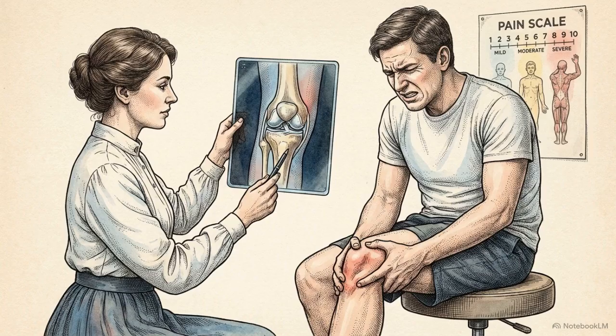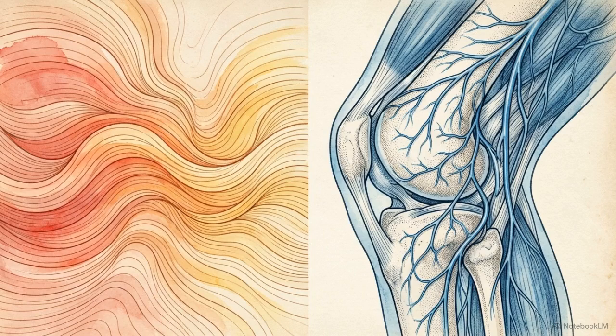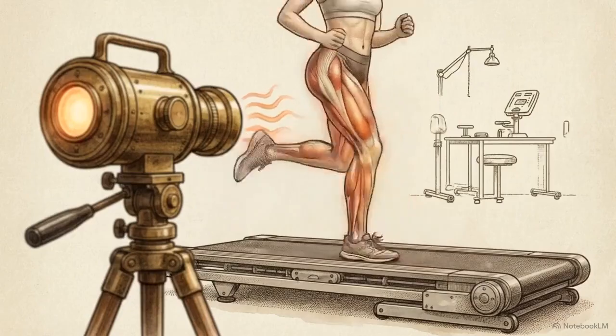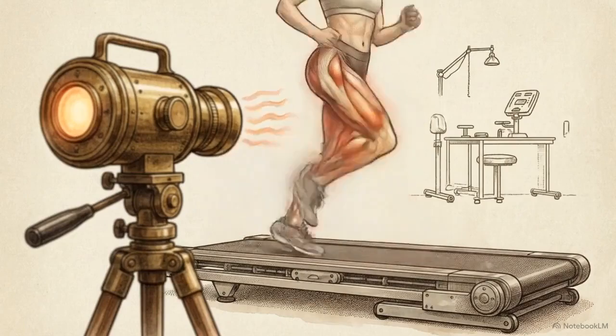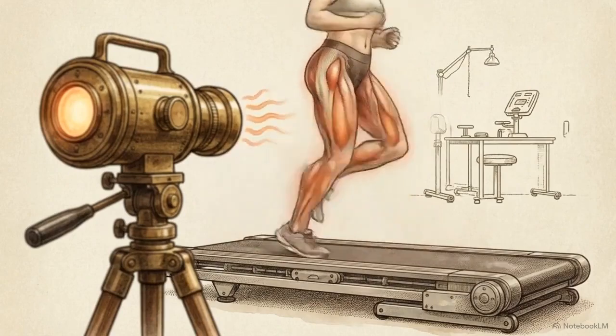This precise tracking process provides a stark contrast to traditional methods, which often rely heavily on subjective patient pain reports or delayed static imaging. Establishing this continuous, non-invasive feedback loop allows physical therapists to design highly personalized and immediately adaptable care plans. The process begins by recognizing the body's natural infrared emissions and ends by decoding the autonomic nervous system's exact response to musculoskeletal injury. When deployed with rigorous technical precision, infrared thermography serves as an objective biomarker that proves the physiological efficacy of physical rehabilitation.